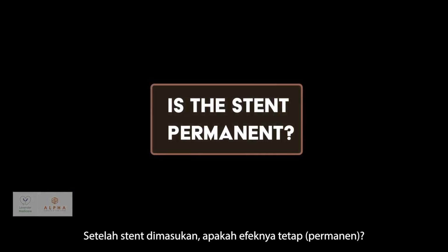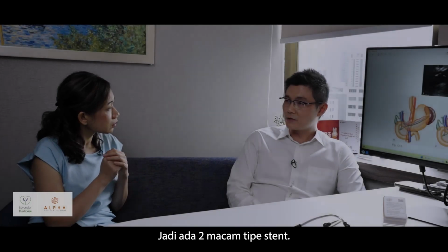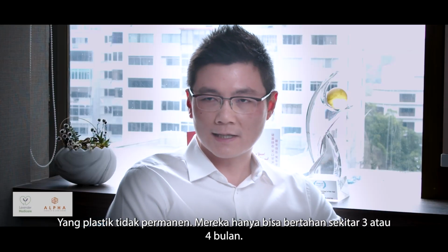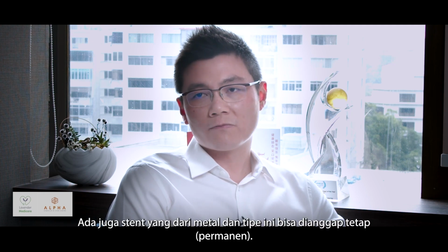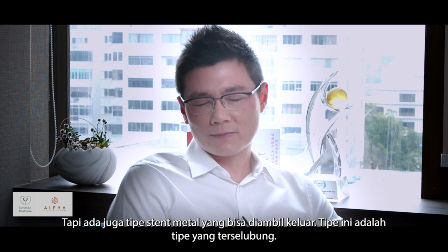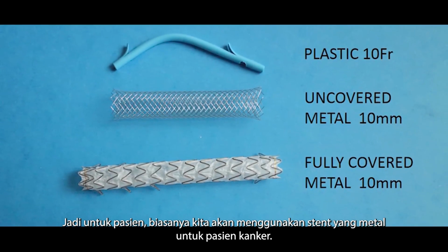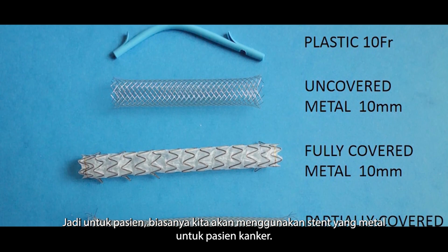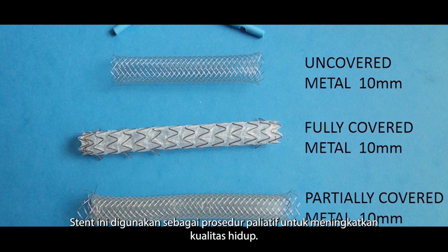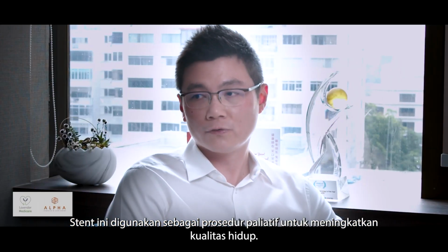Once the stent is put in, if there's any blockage, is it permanent? Yeah, so there are two main types of stents. The plastic stents are not permanent. They're meant to only last about 3 or 4 months. We have metal stents as well, and these are considered permanent, but there are types of the metal stent which can be removed as well, the fully covered ones. So usually we use these metal stents for cancer patients. They're meant to be there as a palliative procedure to help improve the quality of life.